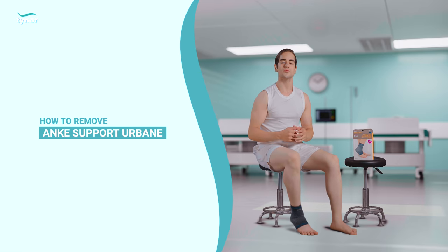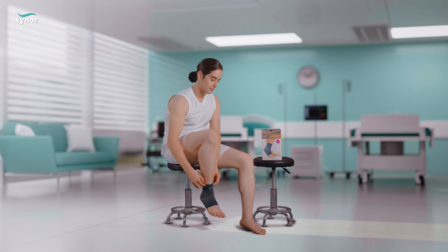Let me show you how to remove the ankle support urban. Pull down the product for easy removal.